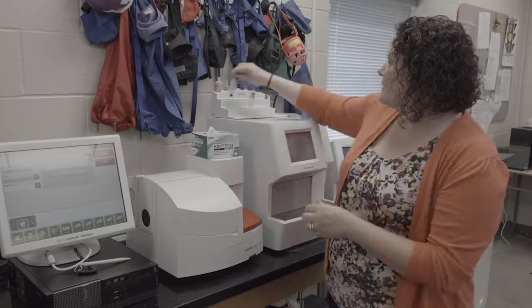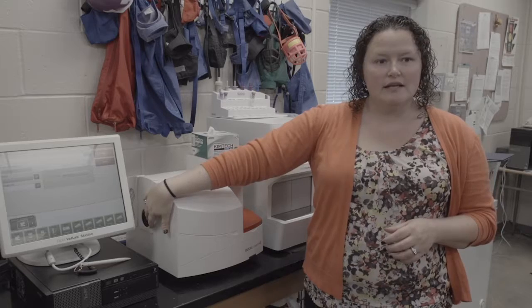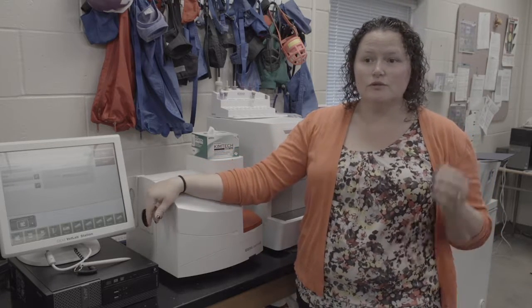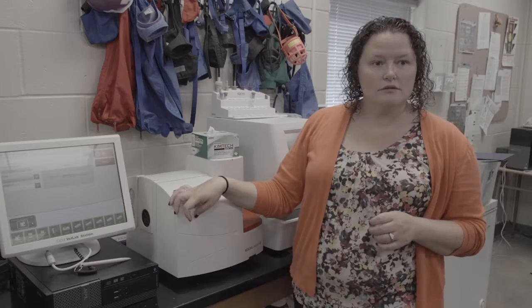Okay. One other little tidbit about this analyzer: do not block this vent on the side, the fan. It can overheat, so don't put charts there, don't put folders, don't put files, because if it overheats, it can actually affect your cells and kill your cells, and then you're not going to get accurate results.